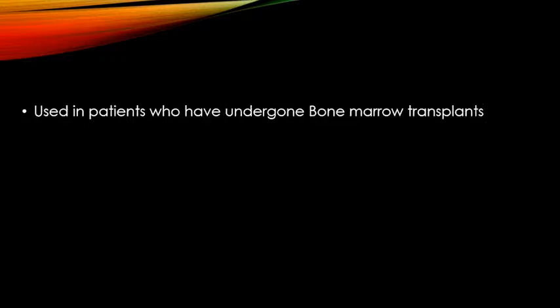Alright, so ARC. What is ARC? Absolute reticulocyte count. Okay? Absolute reticulocyte count and clinical value of absolute reticulocyte count. What is it useful for? That's the question. It's used for patients who have undergone marrow transplants. Okay? It's useful for patients who've undergone marrow transplant.